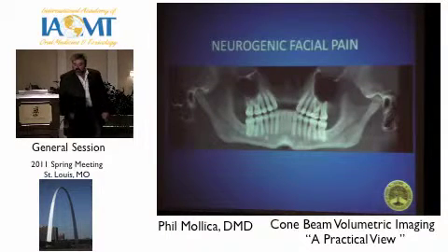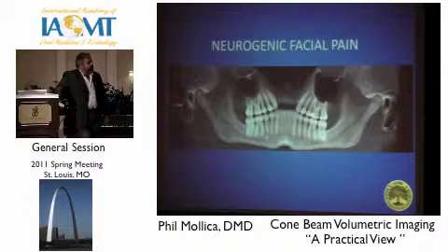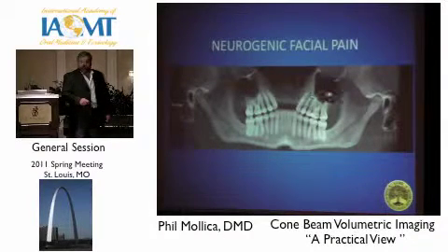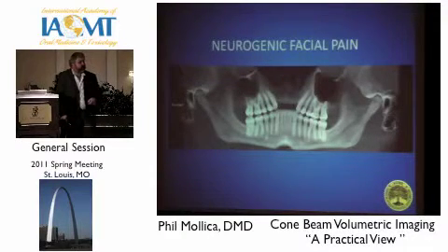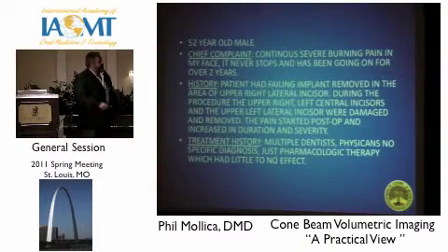This is a golf pro that came into our office. A couple of years ago, he had an implant that went bad. So he had the tooth extracted, the implant extracted. Unfortunately, there was multiple damage done to the other dentition. So he wound up having the implant out and the 3 associated teeth, some light-handed surgeon. Anyhow, he's a 52-year-old guy.